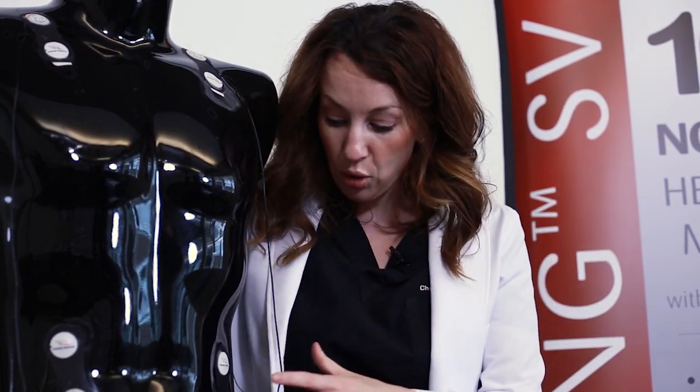For the lower sensors, those typically go at the level of the umbilicus, right? That is where we would want to place the sensor on the lower part of the patient. You do need good skin prep: clean, dry, intact skin, that's what we're looking for. There is a little emery board that comes in the pack with the sensor, so you can lightly abrade your patient's skin before you apply the sensor. They're good for 48 hours. They can go to CT, they can go to X-ray, they cannot go to MRI. You can place a Tegaderm over the sensor if that will help you preserve the life of your sensor a little bit longer. Okay, so that's really good.